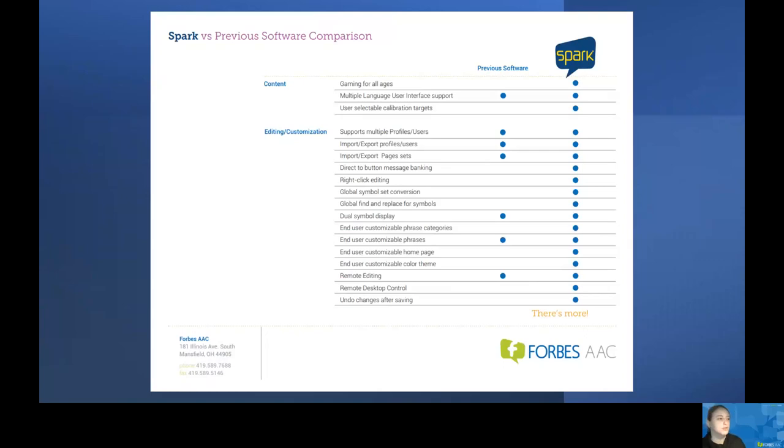There are several things this new software offers in addition to what was provided before. We now have gaming for all ages, which can be a really motivating way to assess eye gaze in older individuals. There's also the ability to undo changes after saving, which can be really beneficial if you're doing some editing or customization. We now offer access to Office 365 as well as the ability to schedule calendar appointments with alarm notifications all through the Winslate. You can also do a global symbol set conversion as well as a global find and replace for symbols to really personalize it for the user — so instead of going one by one, button by button, you can do a global replacement.